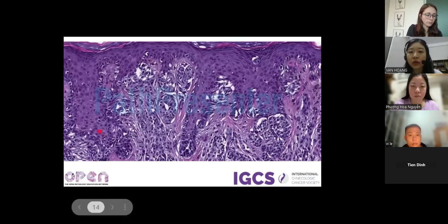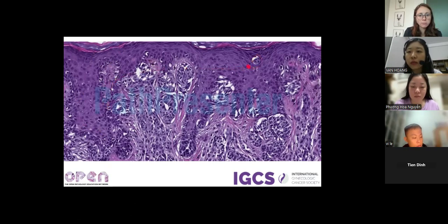And we also have inflammatory infiltrates surrounding the vessels in the superficial dermis. In higher views, again we see the nests and single cells located at the dermal-epidermal junction and some cells within the epidermis itself. In the dermis, it contains nests and sheets of similar cells. And we can see here the dermis shows some features of solar elastosis. It's the bluish color in the background.